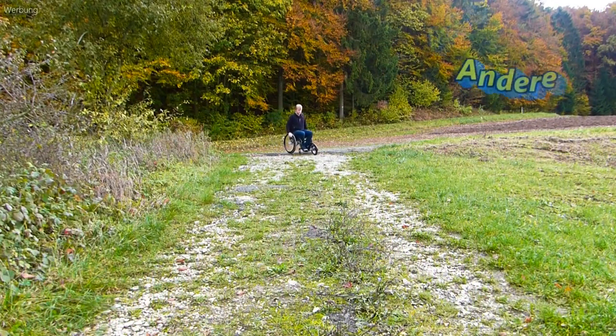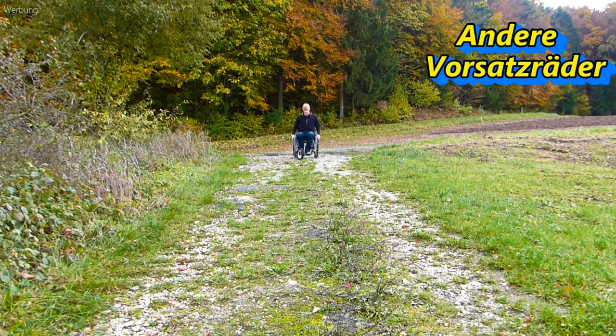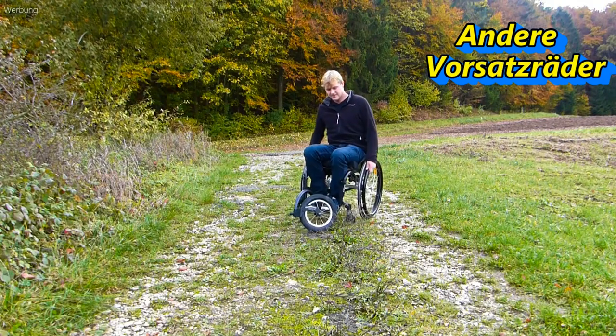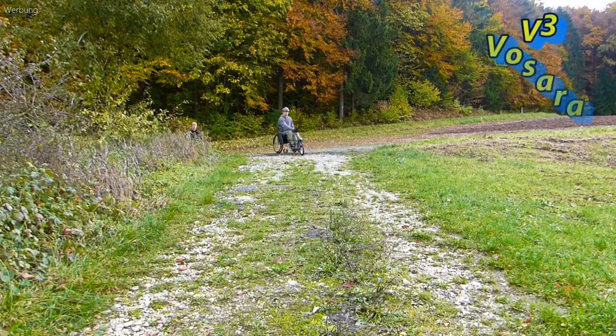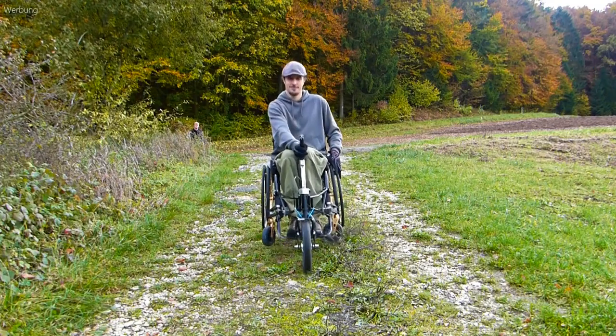If it is not only steep but also uneven, the whole thing is much more difficult, because you have to constantly correct the braking force on both sides to keep the lane. With the Vosara it looks very different — again, the one-hand handlebar makes the whole thing simple, safe and fun.